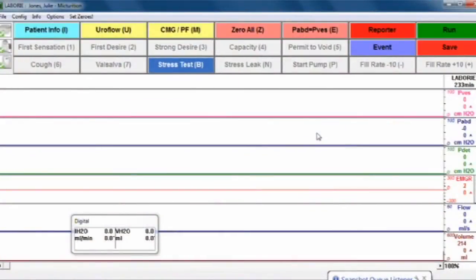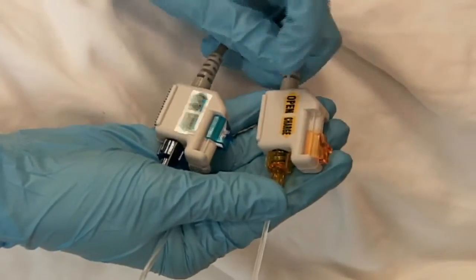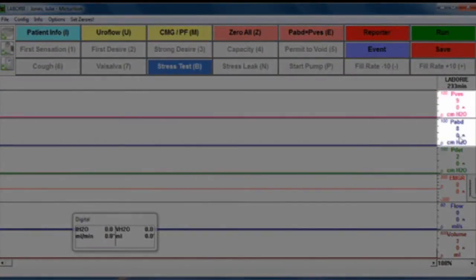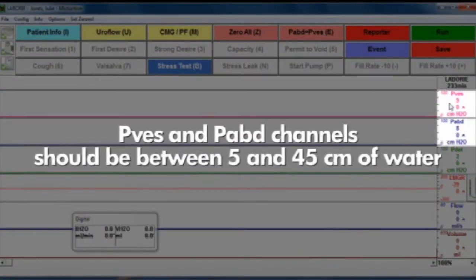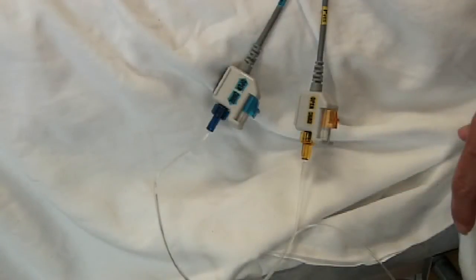Click on zero all, or press the letter Z, while the transducers are still in the open position. Then switch all transducers to the charge position. Next, you'll want to observe the PVES and PABD channels. They should be between 5 and 45 centimeters of water and within plus or minus 5 of each other. If they are not, it's very important to check that either catheter has not slipped out of position and adjust them accordingly.